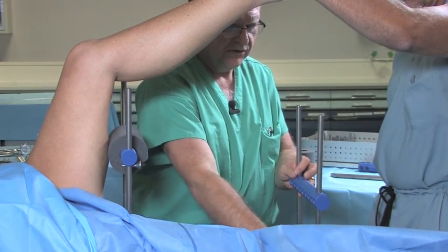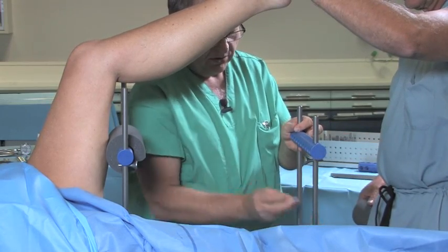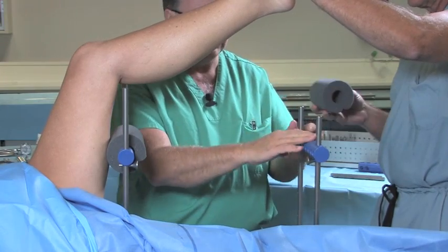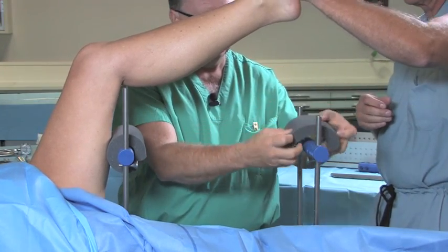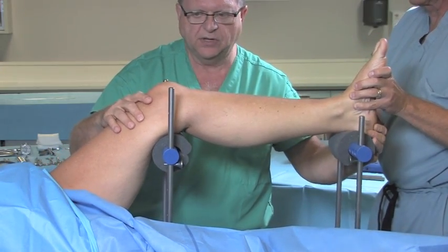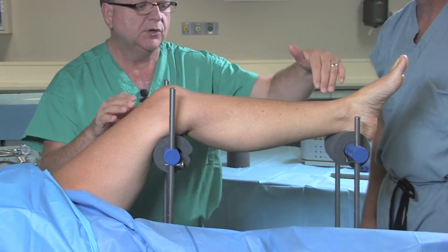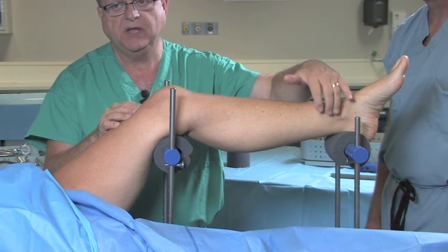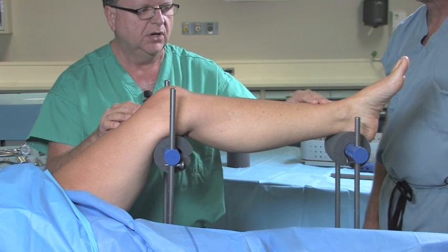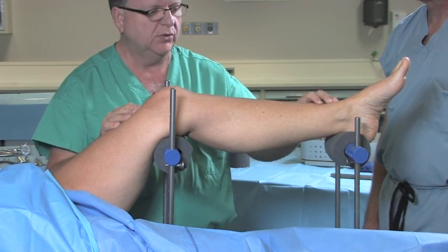We'll also use the 4-4 hole pattern for the distal goal posts. Apply our leg pad. Now the leg is in a position that's parallel to the floor, making it easier to do AP and lateral visualization of the distal tibia locking sites with the C-arm.